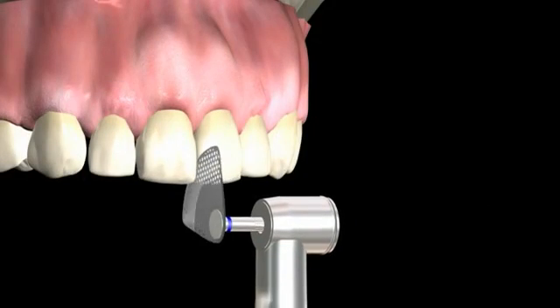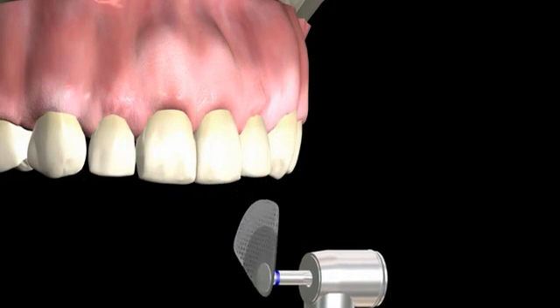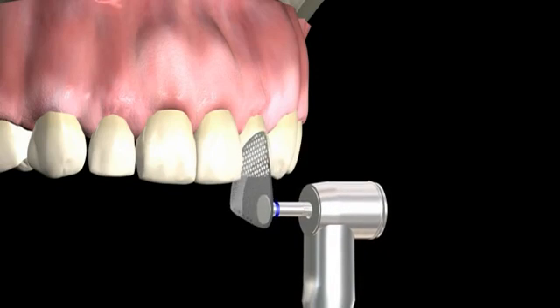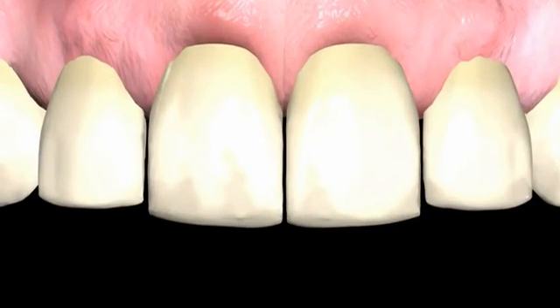Enamel can be reduced by the exact amount necessary for aligners and orthodontic procedures. The thickness of the oscillating discs is 0.05mm less than the required dimension.